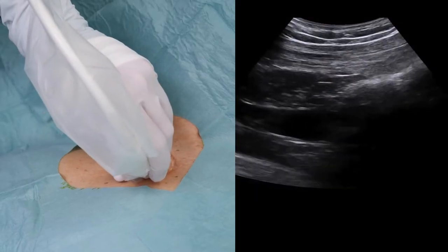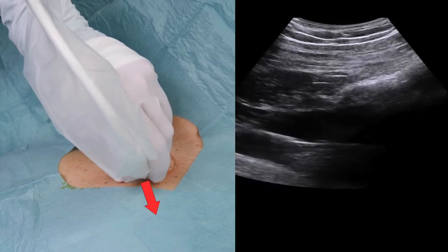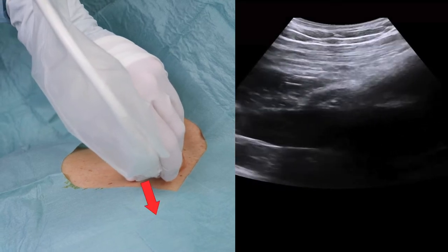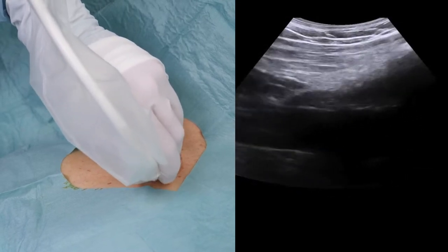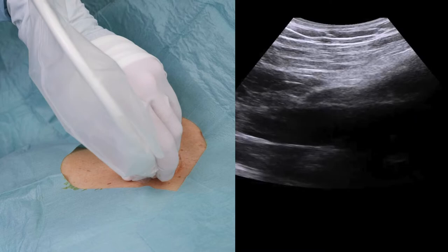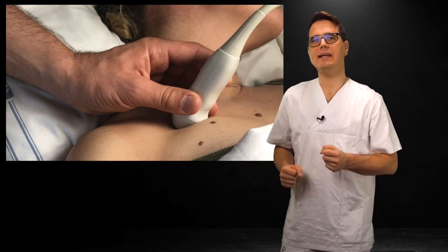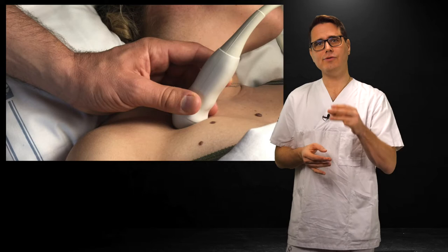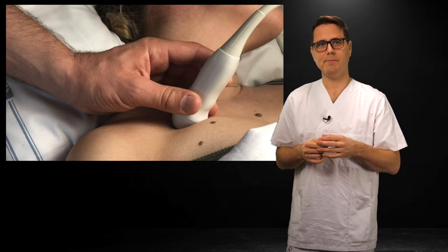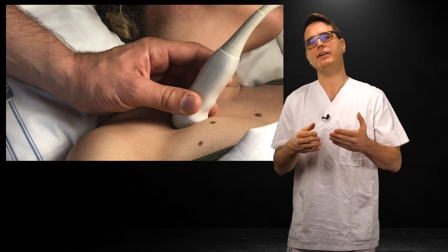First, achieve a perfect long axis view of the vein. Use a small sweeping motion back and forth to assess how wide the vein is and thereby where the dead center is. At this point, the vein is black and you have the crispest wall-blood interface. Once you have the perfect picture, you should never move your probe. It will help a great deal if you rest your wrist against the patient and use three fingers to grip the probe firmly. You'll feel an urge to move the probe to find the cannula, but then you'll have lost your perfect alignment with the vein. The trick is to move the cannula, not the probe. I cannot overstate how important this is.